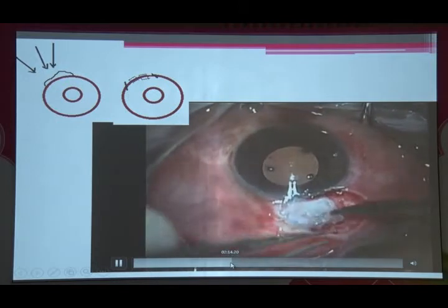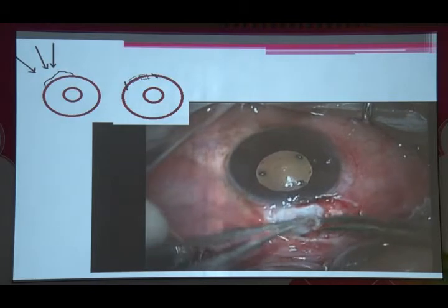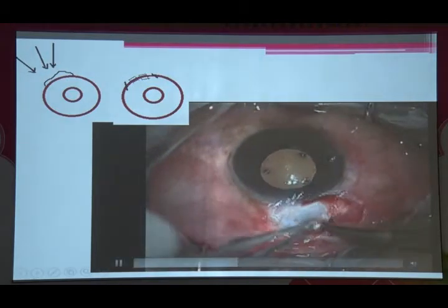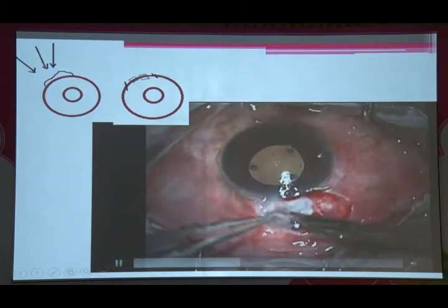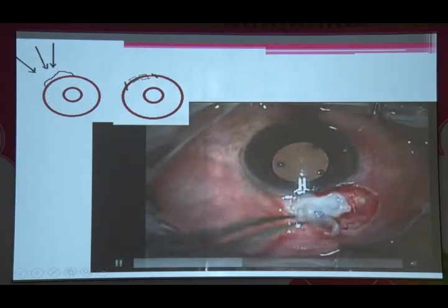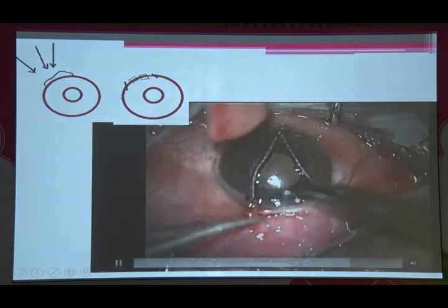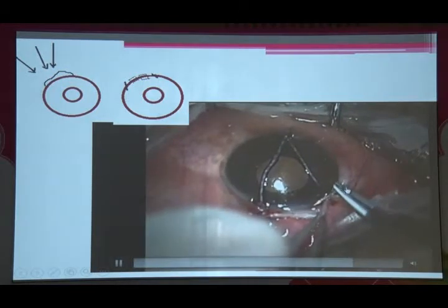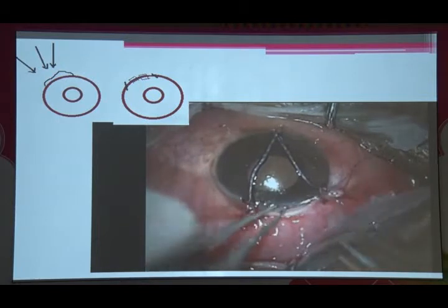What you're then trying to do is hold the edge of the outlined area. As you can see, this area is over the area of the bleb. The epithelium is just peeling off. You're just cutting the posterior edge, and the rest of the epithelium is peeling off. Subsequently, all you need to do is make sure that you've replaced that area and made it completely watertight so that your bleb begins to function immediately.